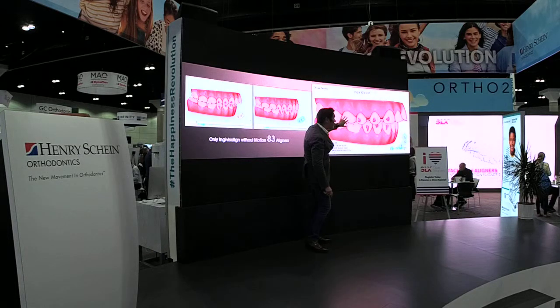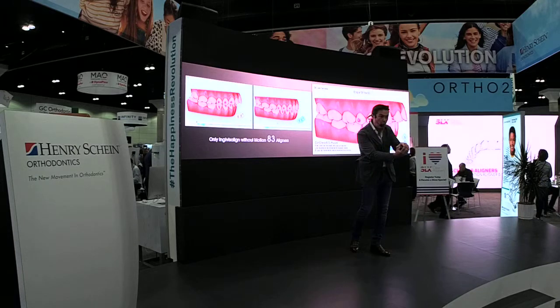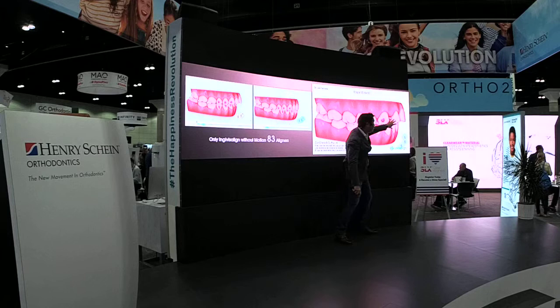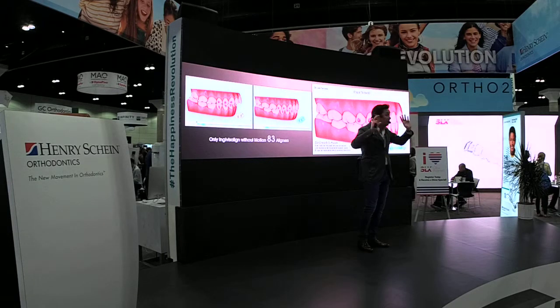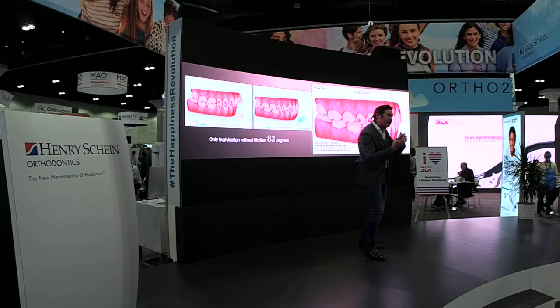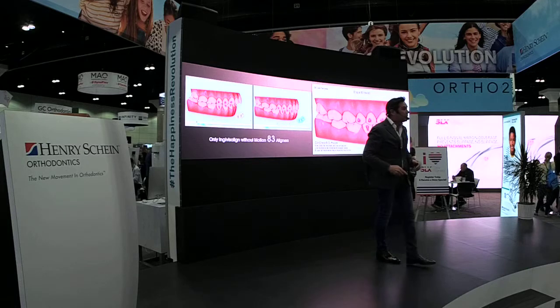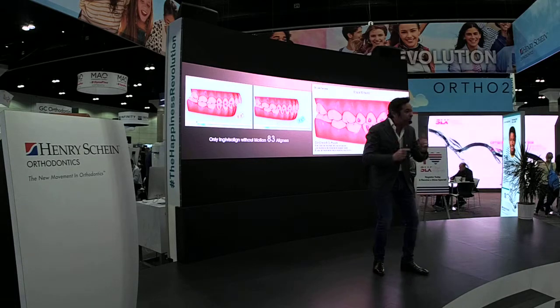So if we establish a class 1 like this, and we do not invite the mandible forward to release the temporomandibular joint, what will happen is that when we bring this back and we accomplish class 1, we will generate a chronic problem of the temporomandibular joint, because we are locking any future possibility of inviting this mandible to be repositioned forward and releasing the stress on the disc position. So this is very important.